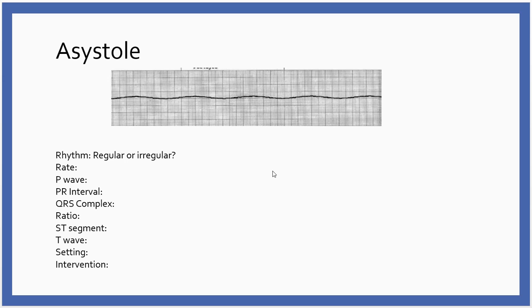You may see with asystole, it is recommended that if we see this on the monitor, we check in a different lead also, because it's possible that the patient is in just a very fine VFib and not asystole. And if they're in VFib, we know that we can shock them and we have some other options for them. But this is bad news.